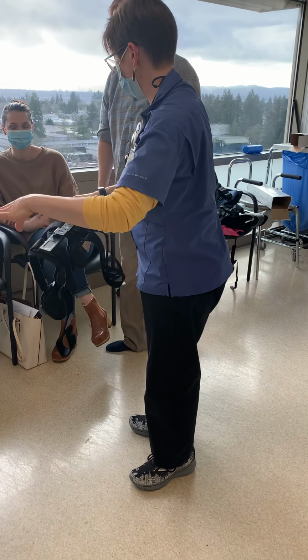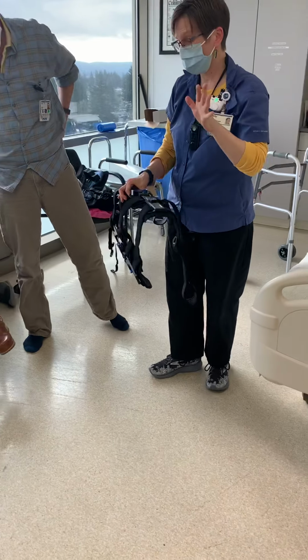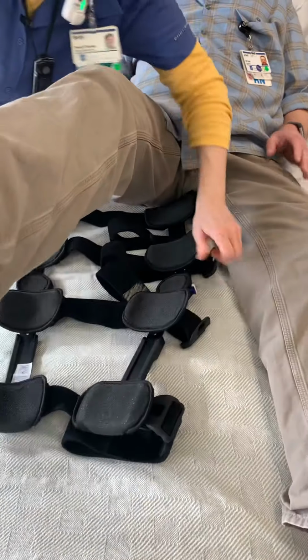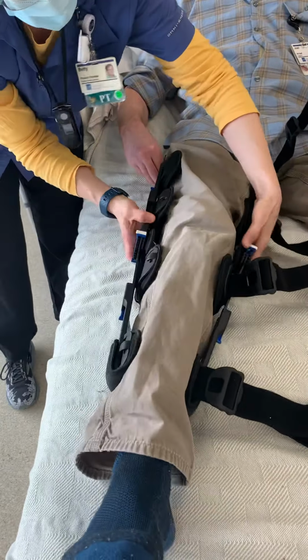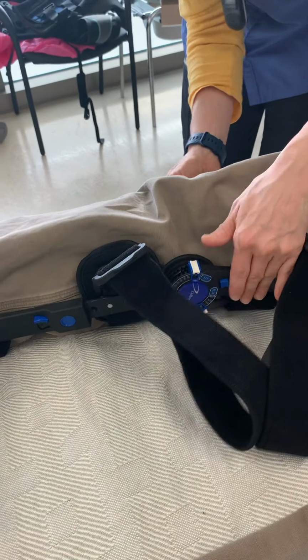The length is easy to do. The setting on the hinge is not so easy. So generally, when you put these on, it's very similar to the knee immobilizers. If you have a really nice, compliant patient that can hold their leg up for you, it's just fabulous. Okay, so then right here we're doing right around his knee. We're getting that dial hooked up around his knee.